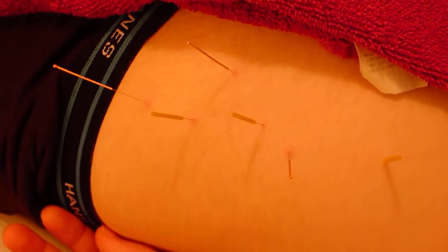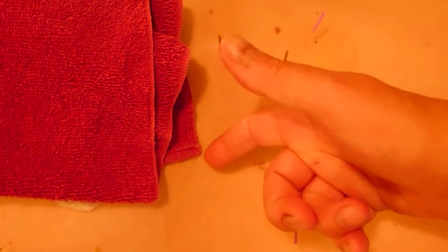He also has a very tight low back, so I've released the motor point of the quadratus lumborum, and I've also done some of the paraspinal muscles on either side of his lumbar spine at the level of L2-3, and also on the left at L4-5. The reason there's a needle on the left and not the right is because I needled the right and it was very loose and relaxed — there was no need.